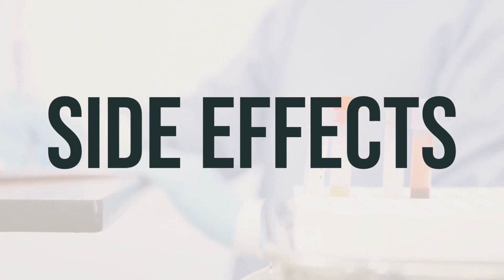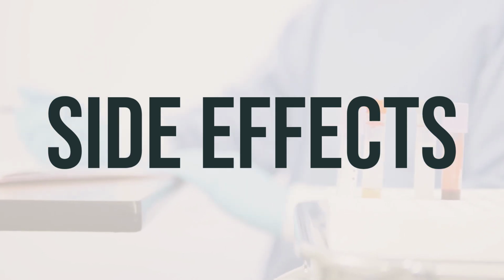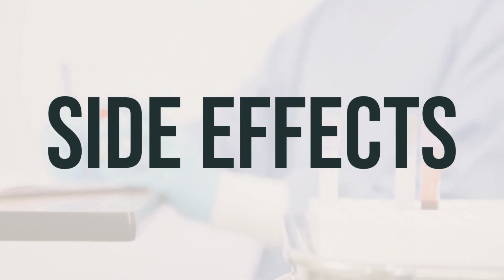After the placement of the Paragard T380A 380 square mm intrauterine device, you may experience temporary pain, bleeding, or dizziness. Your periods may become heavier and longer, and you may also experience frequent vaginal bleeding between periods. If these effects persist or worsen, it's important to inform your doctor.